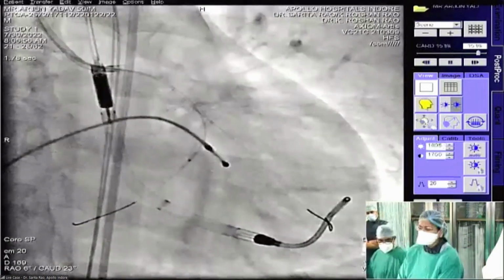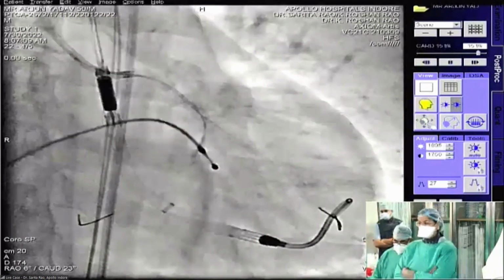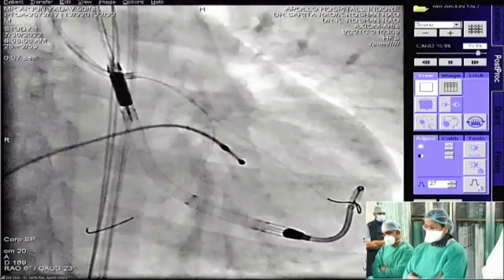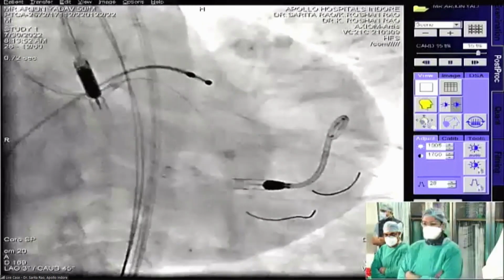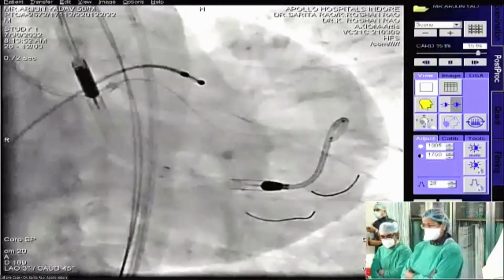So the OM lesion was actually at a trifurcation. We ballooned the other two vessels. Next, please. So this is post. Next, please. Went into the middle vessel. We ballooned that as well. Next, please.